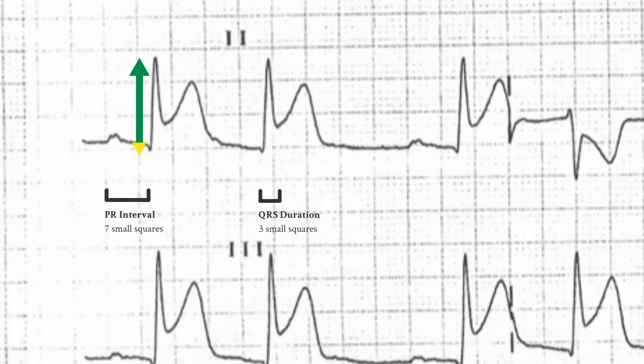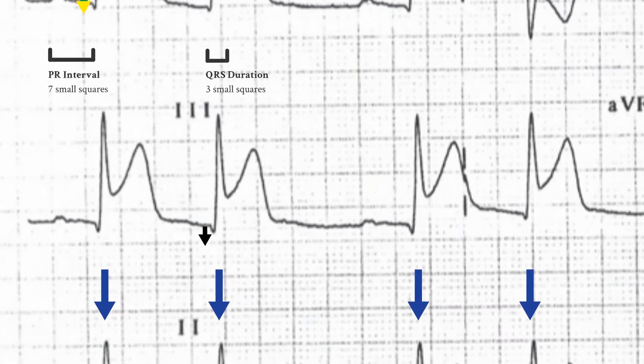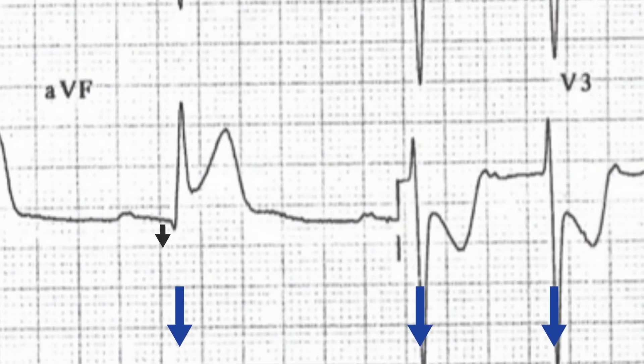There are small Q-waves present in lead 3 and AVF, but these are too small to be classed as pathological Q-waves. They're likely to develop into them, however.